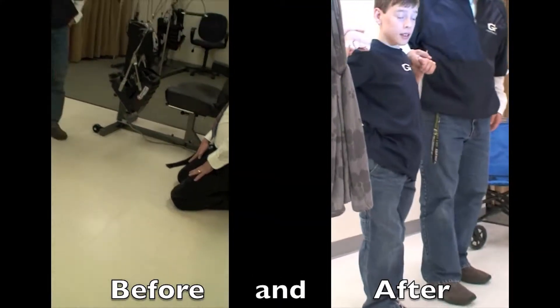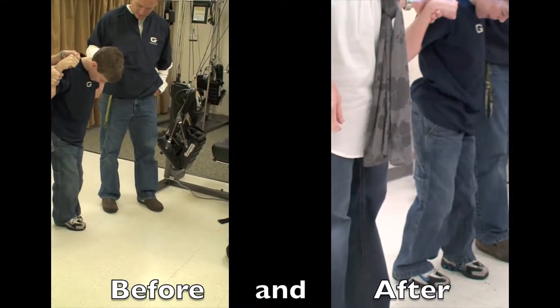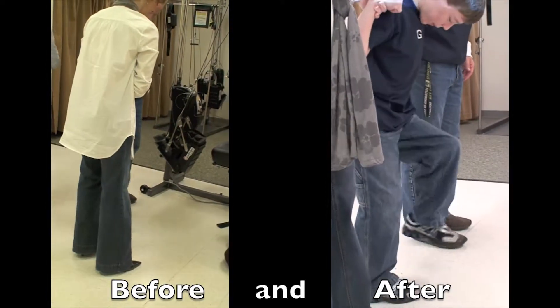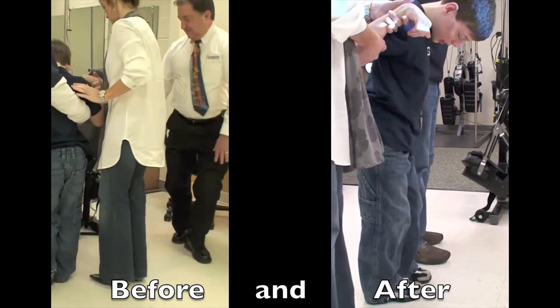Keep your feet apart a little bit. Now that's better. Look — he's not stepping on his toes now. His toes aren't turned in like they were. Look at that. He's stepping straight, not scissoring at all. And I was having to hold here to help support, and I'm barely having to now.